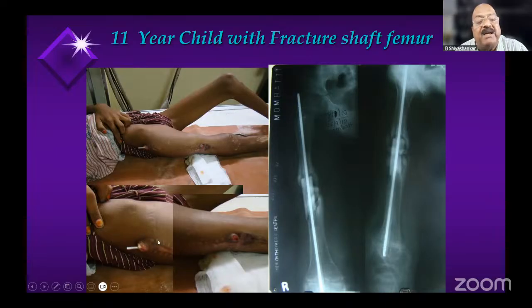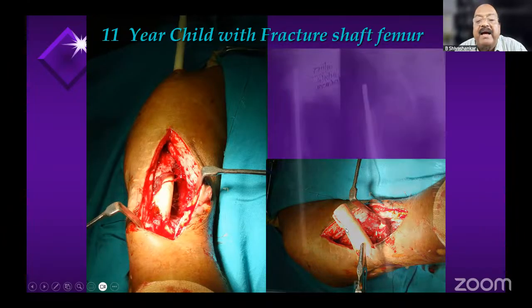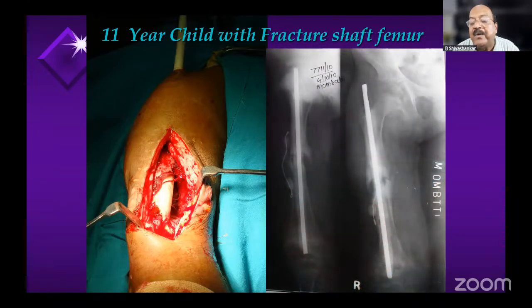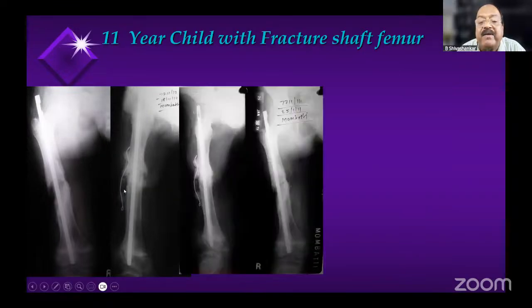He used to push it in by his hand. It was so loose inside. What I did was remove the ivory bone, the dead bone piece. You can see I inserted an antibiotic coated K nail. That was the time I was still using antibiotic coated nails, and I also added an antibiotic wire there.